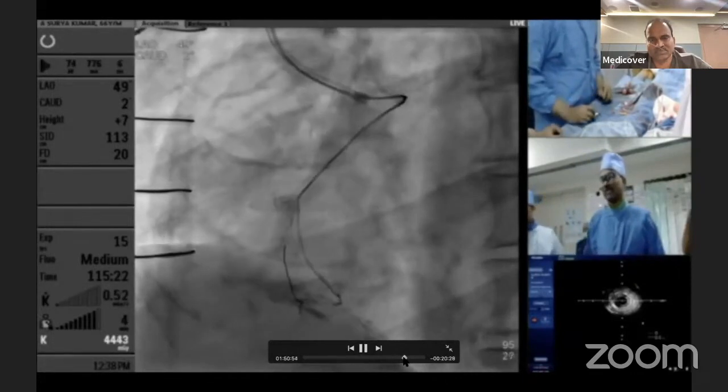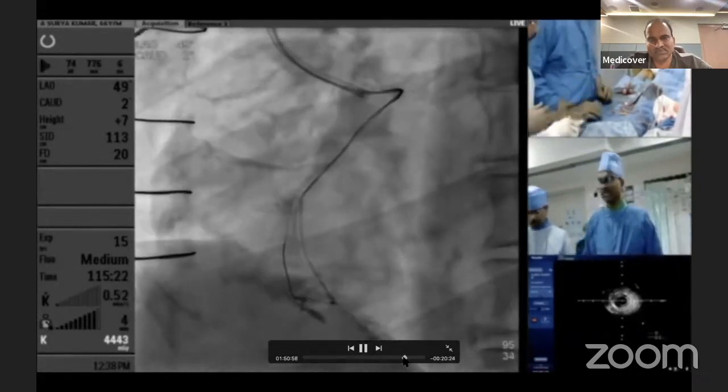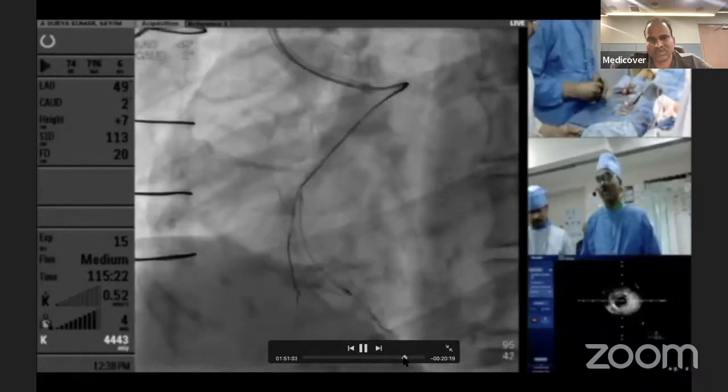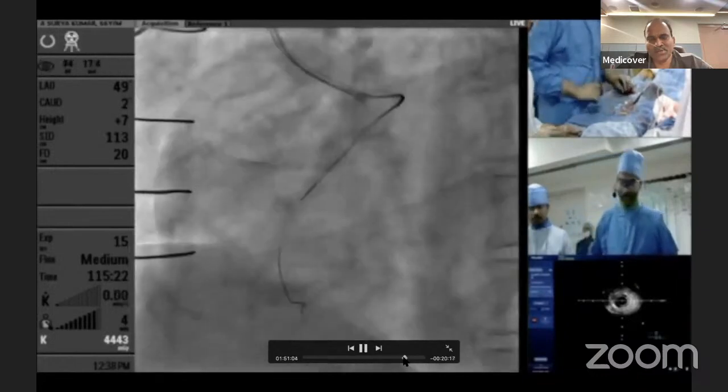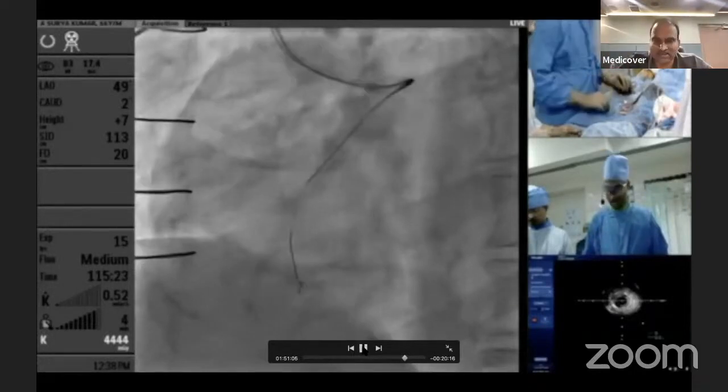But this picture is very scary that you are taking. No, Dr. Vijay, we see the whole right crux with a large hematoma. Yeah, it looks that way. But no need to worry, your PDA is filling and PLVB is filling from the other collaterals. So where I am injecting from is a septal which is connected at the crux. And the reason we are not able to see the entire PDA and PLVB is because they are filling nicely from the collaterals.